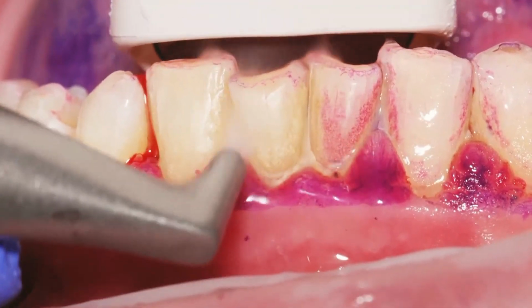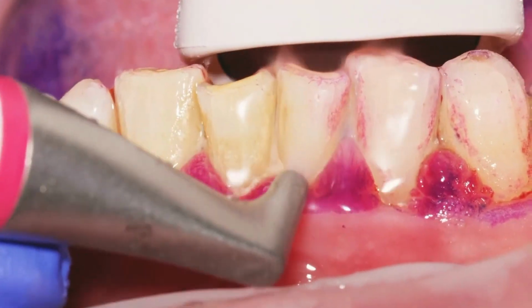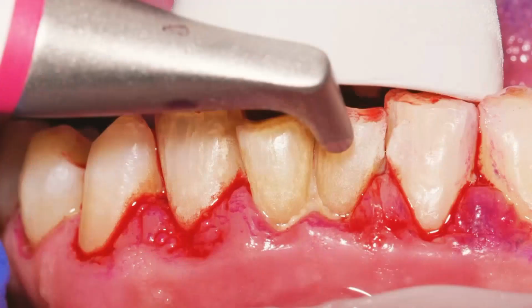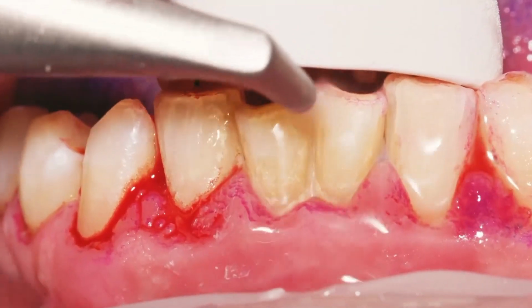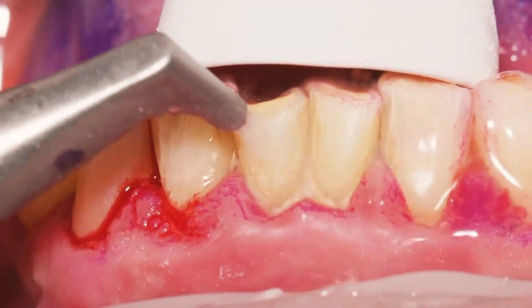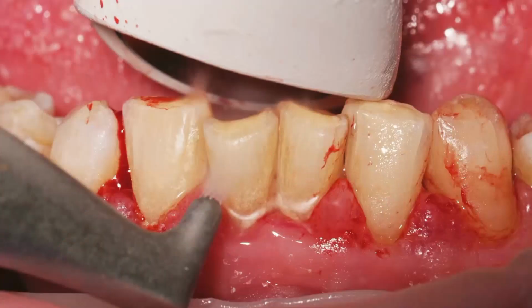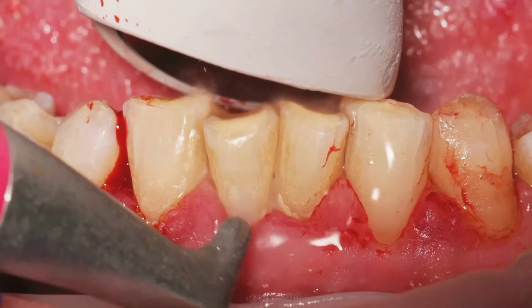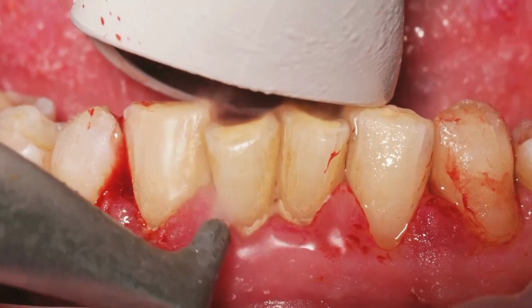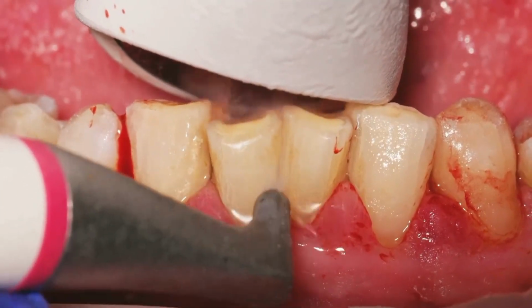Of course, the patient has bleeding on treatment, because the patient has a periodontitis with a high level of inflammation, as you saw during the assessment and diagnosis probing. So during treatment, especially here in the subgingival area, you deliver the powder in the subgingival area, in the sulcus, but especially into the areas where we have pockets.